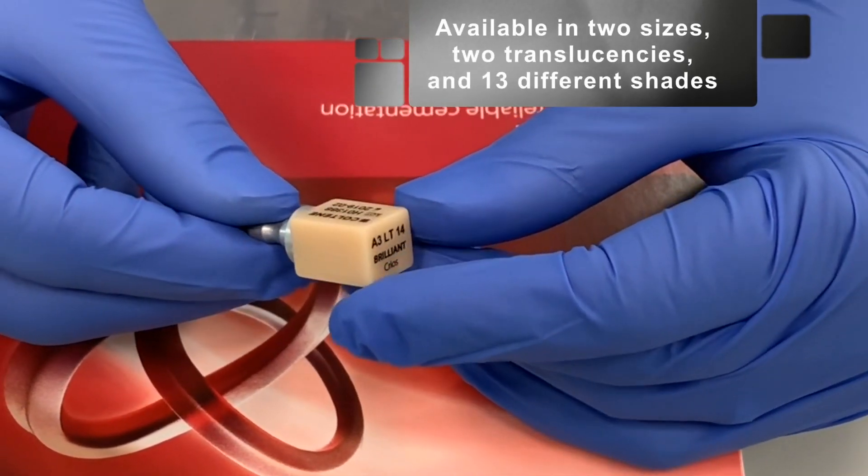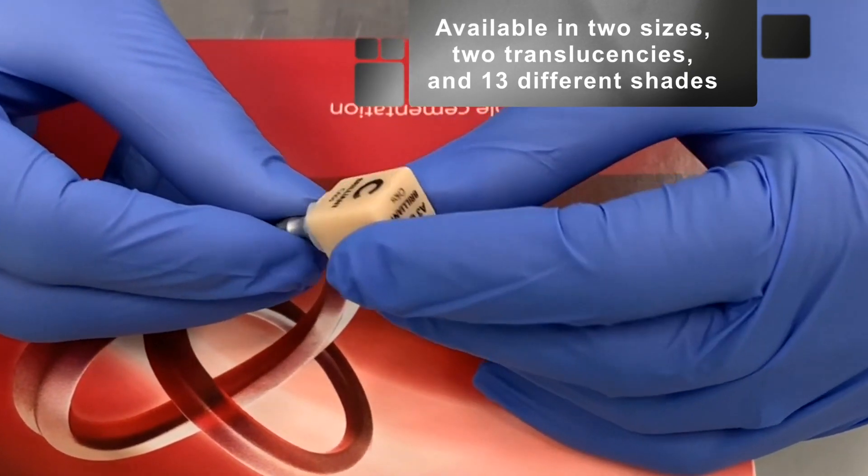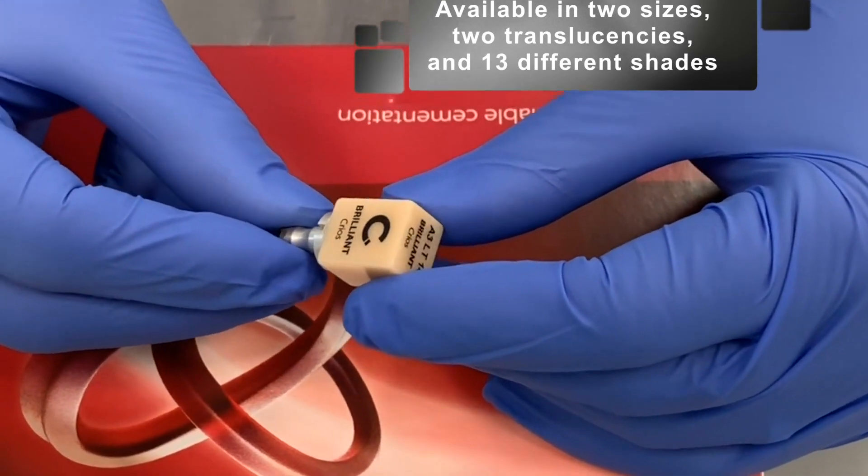The block contains excellent mechanical properties and is available in two sizes, two translucencies, and 13 different shades.